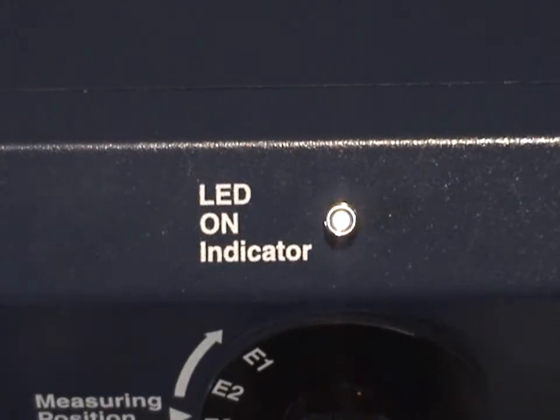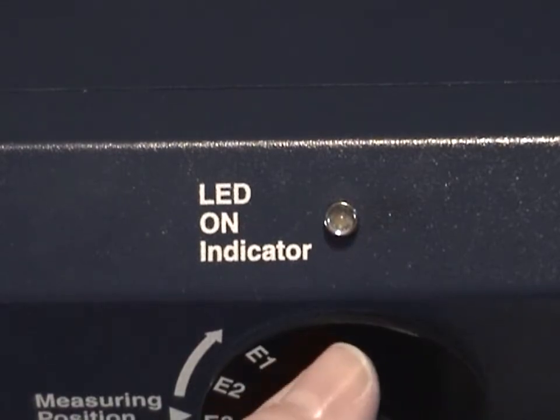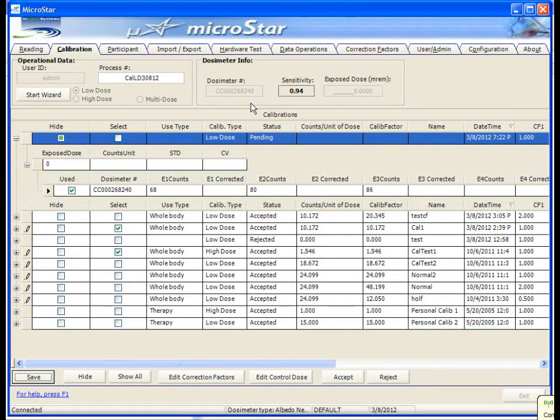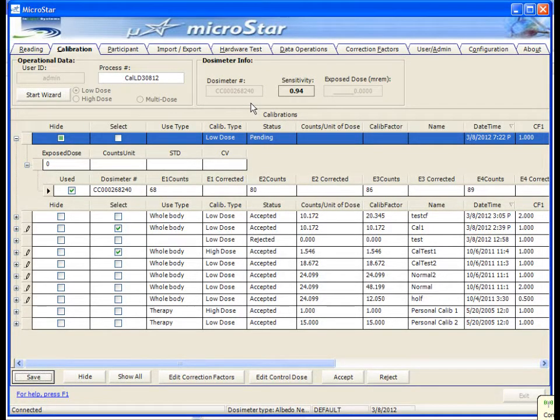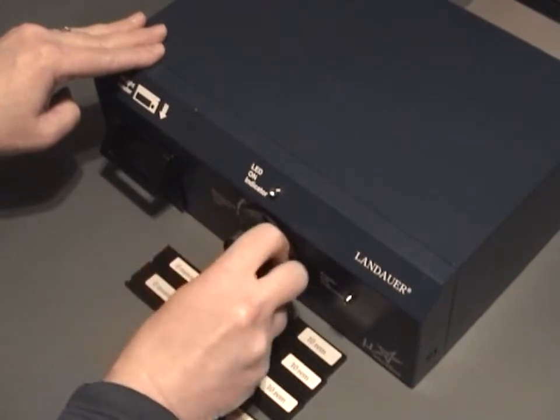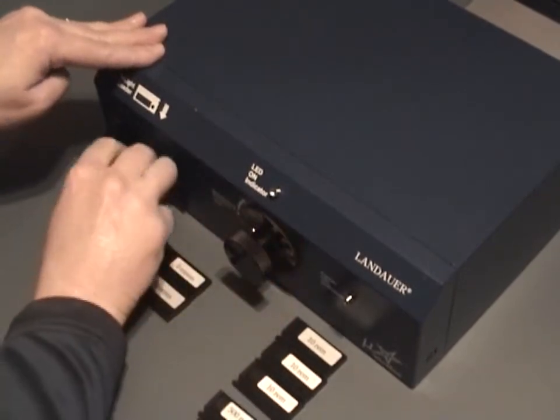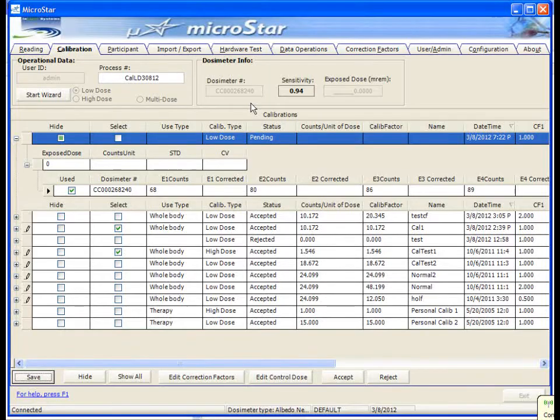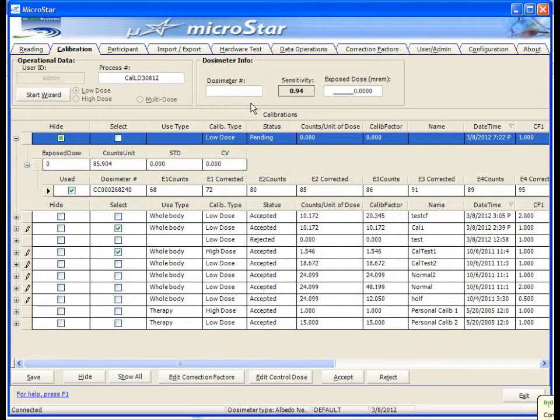Continue this to read all four positions. As each element is read, the counts are displayed on the calibration grid. When all elements are read, turn the knob counterclockwise to the HP position.